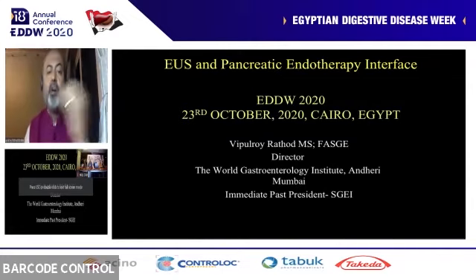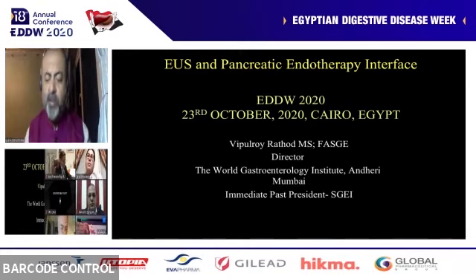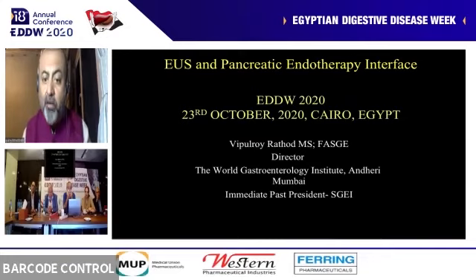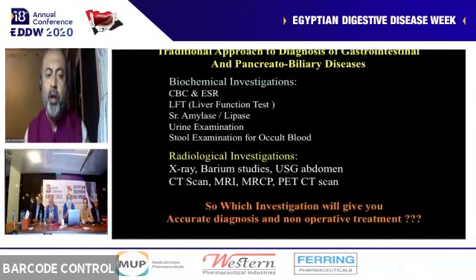Anyway, Professor Serag said that we are short of time, so I'm cutting my talk in half. I'm skipping the entire biliary part. I'm focusing on pancreatic endotherapy and endosonography confluence. So we all know the advances in endoscopy over the last 100 years. I'll just give you a little brief history and then we move on.